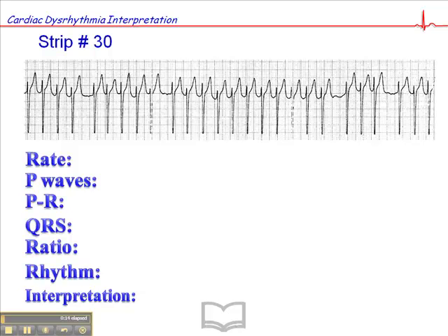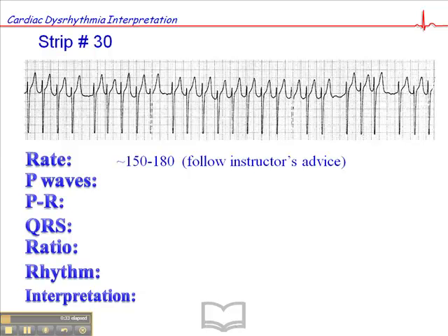At a glance this looks like a very fast rhythm, a tachycardic rhythm, and the heart rate is in fact somewhere between 150 and 180. And because the rhythm is irregularly irregular, there'll be some differences of opinion as to what the heart rate is. But again, as I mentioned earlier, when you have an irregularly irregular rhythm like this, you want to have a heart rate range which is reflective of the patient's sort of average heart rate range.